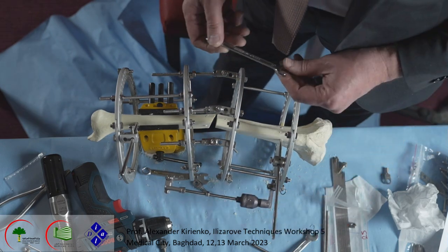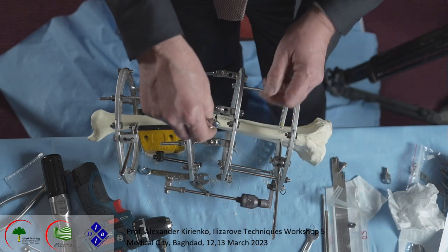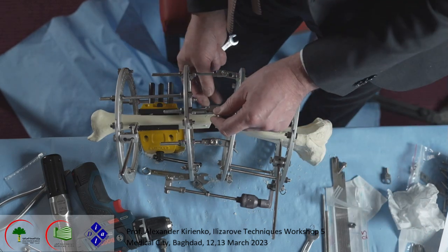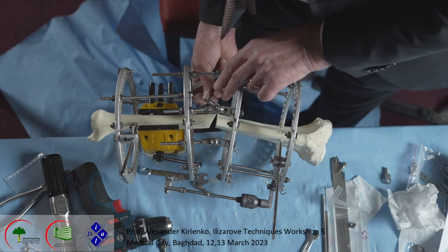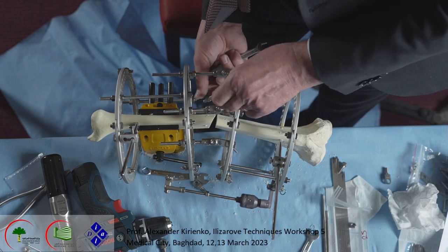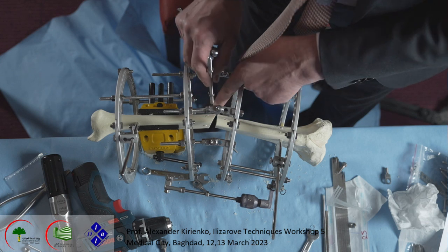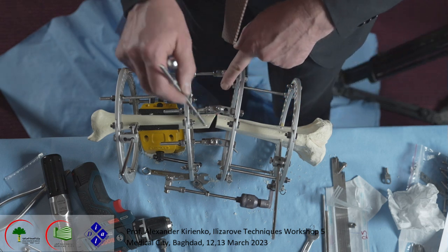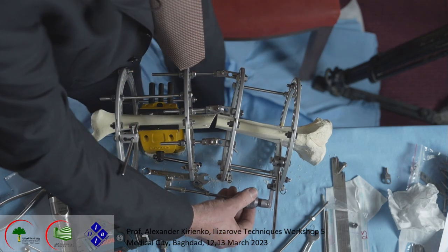And like I explained, my hinge is touching the external border of the bone, just a little bit external, like you see here. And this permits me to do lengthening. Just a little bit of lengthening on the lateral side and much more lengthening on the medial side. And continue.